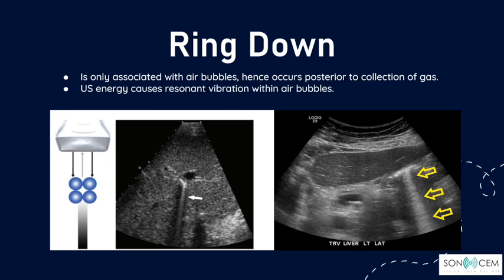Ring-down artifacts are seen in association with air bubbles. Interaction of the beam with the air bubbles results in a continuous wave of sound transmitted back to the transducer. The image on the left shows a ring-down artifact in a case of pneumobilia, and the image on the right shows a ring-down artifact in a case of pneumoperitoneum.